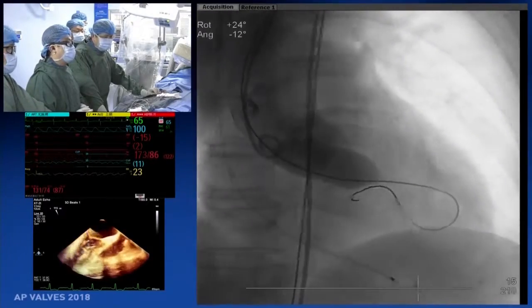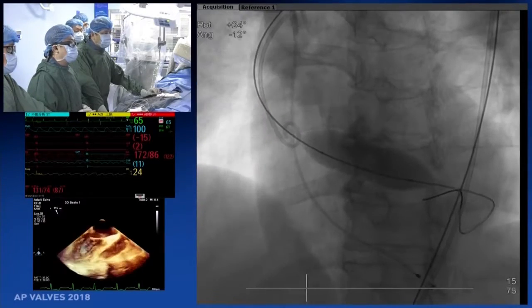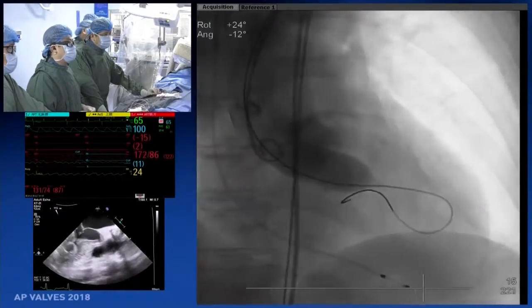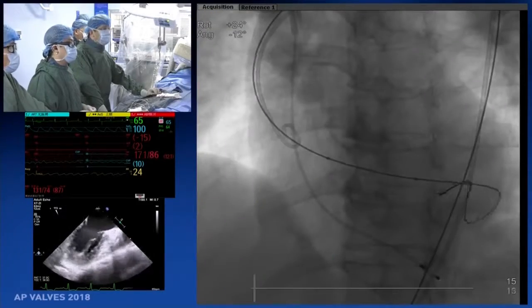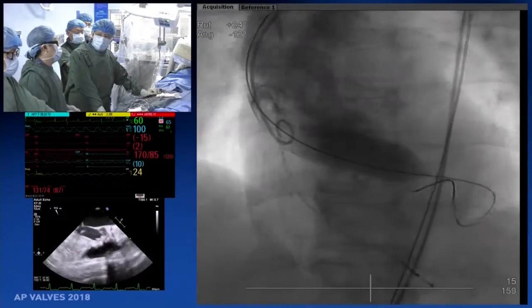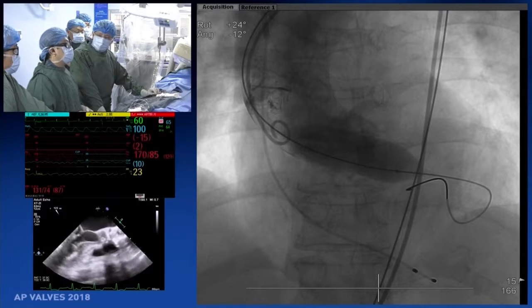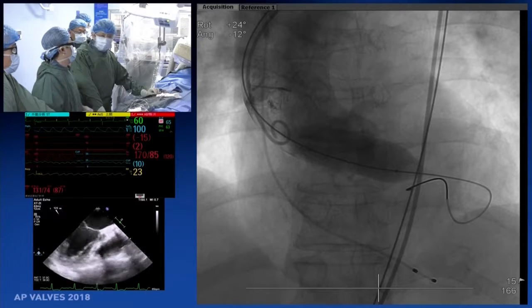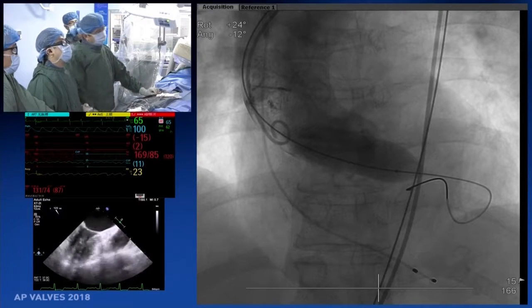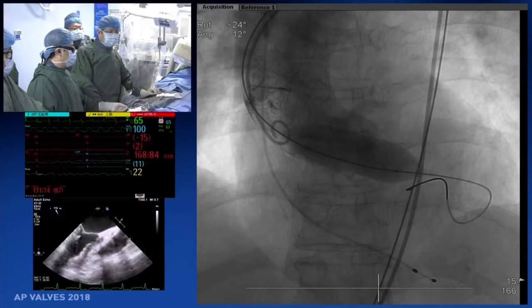Professor Wang, for this sort of bicuspid aortic valve, do you do any CT sizing beforehand, using the CT images instead of using the balloon? Absolutely, we use CT. Dr. Liu already showed you the CT. Actually, from the CT scan, the parameter derived is 22.3. So we use 26. For this patient, the CT scan and the balloon sizing are the same.